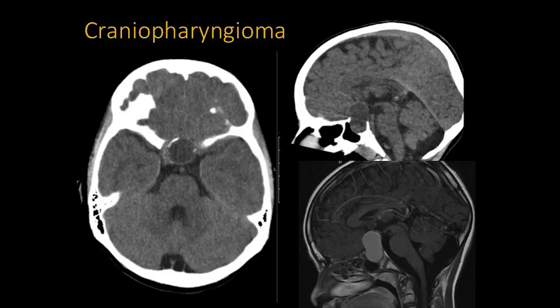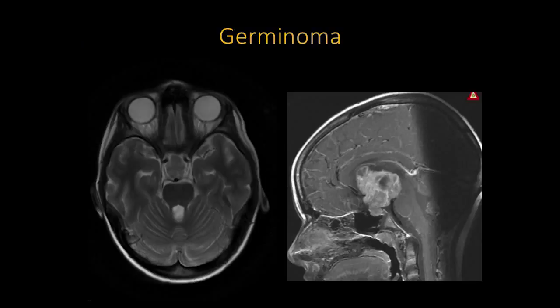This different patient shows an axial CT with a lesion in the suprasellar system that is much darker than the rest of the brain, with some calcification around it — very unusual for a hypothalamic hamartoma. The sagittal images show the lesion extending into the sellar region where the pituitary sits, and then superiorly, with the mammillary body visible but other structures distorted. This was a craniopharyngioma — a different tumor primarily located in the sellar and suprasellar region, which can grow very large and extend posteriorly into the mammillary body region.